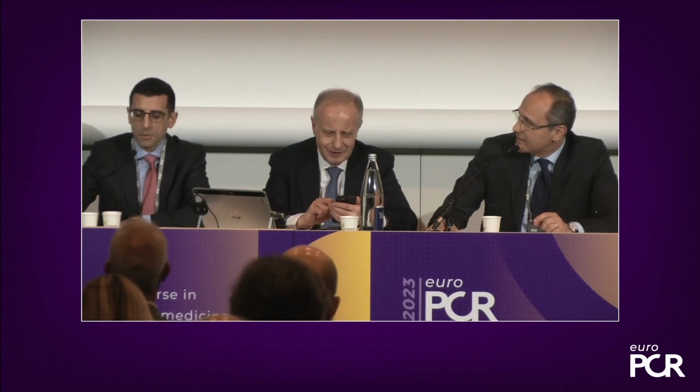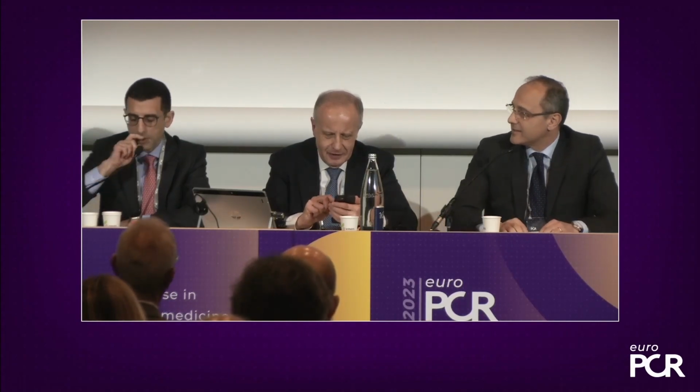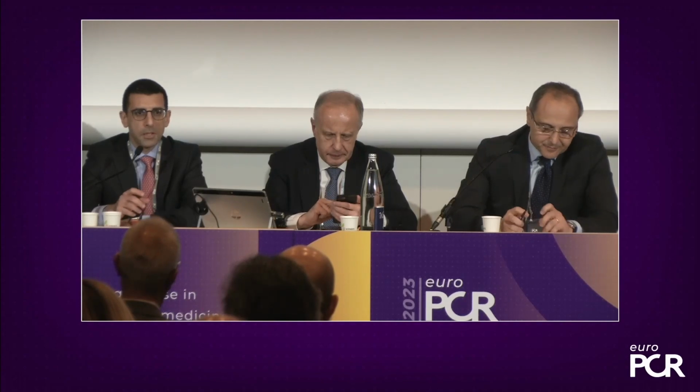Salvatore? Yeah, just a small tip about the pressure wire. We talk a lot about the distal tip, to preserve the pressure sensor, but the proximal tip is also the one we use for crossing balloons, stents, etc. And that is the tip we need to connect to make the measurement. Sometimes, although the pressure sensor distally works, we break this proximal tip, and we are not able to connect again with the console to get our measurement.